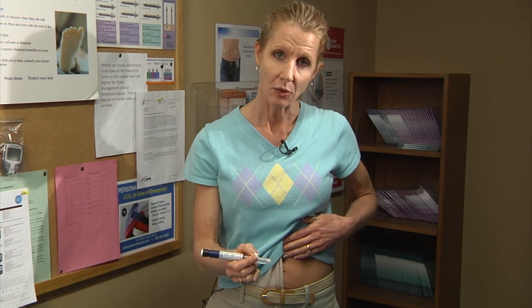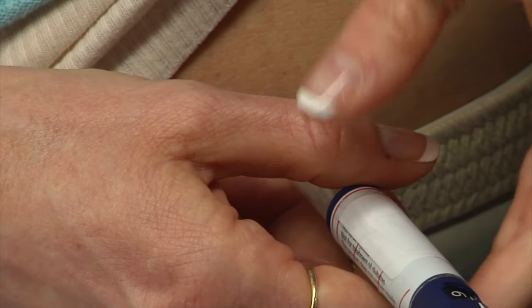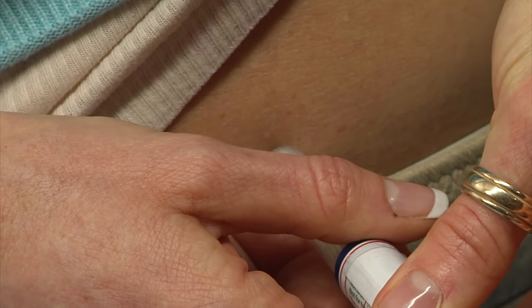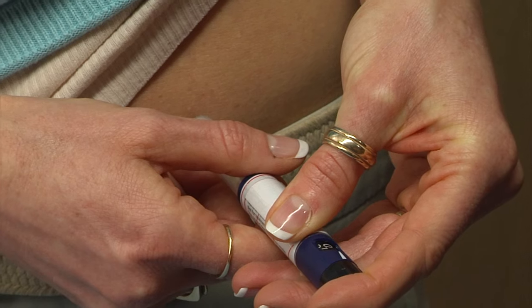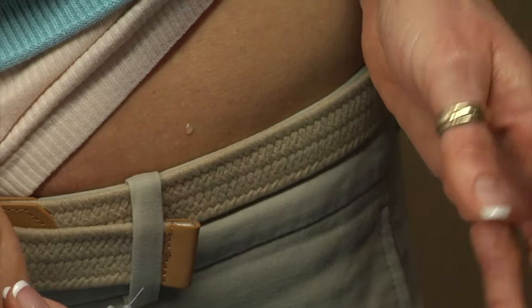Expose the injection site. Hold your pen like a writing pen or a dart, then go straight into the skin. You can use the other hand or the same hand to push on the injector button — you'll feel it and see it rotate as it's injected. Once you've injected the entire solution, hold it for 10 seconds before removing the needle.